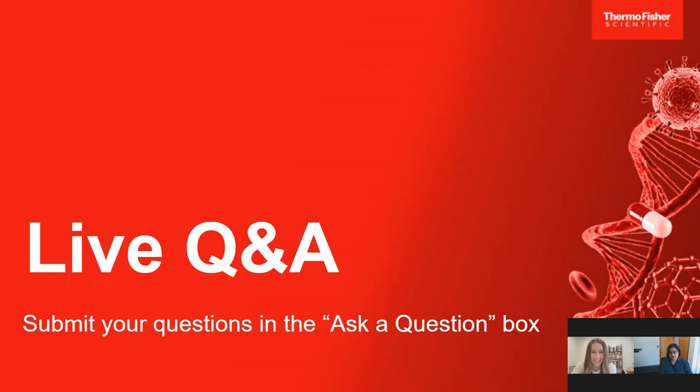Thank you. Our next question here is, do you think it is mandatory to use normal IgG as a control of the primary antibody? If so, please leave tips. It's not mandatory. It depends on what you want to do. But basically, I never use it. So it's up to you. If you want to use a normal IgG as a control, you can use it, but it's not mandatory.